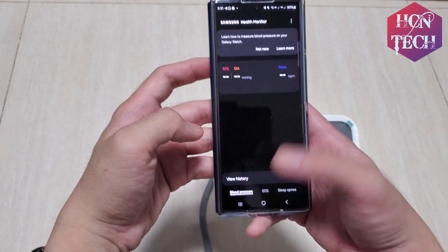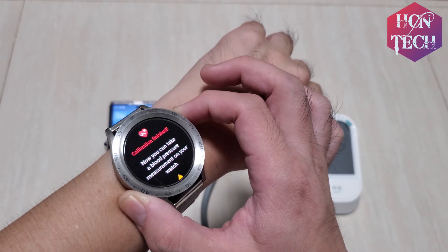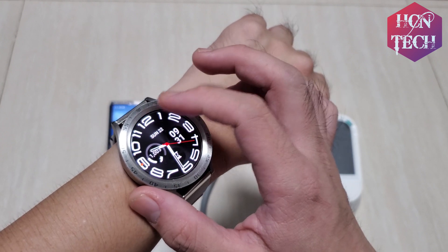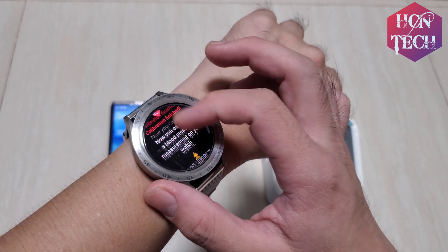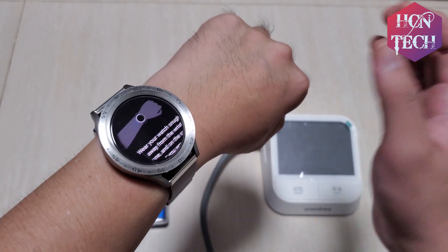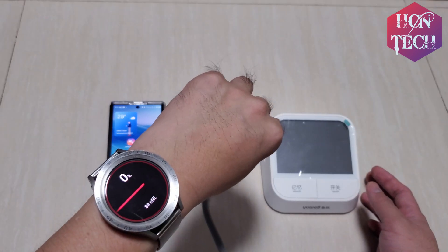Let's see how it works. Now I find the blood pressure monitor on my wrist — let's see how it measures. It's okay, we can start now. Measure.